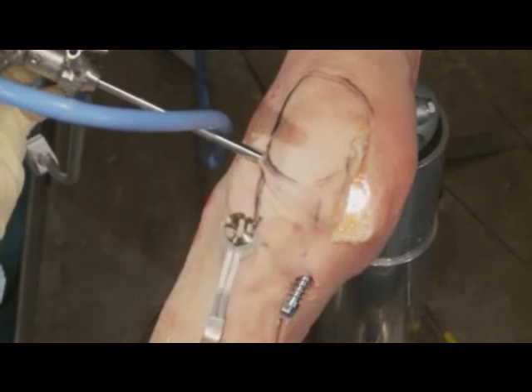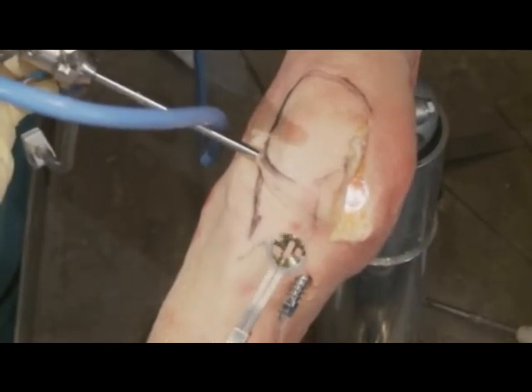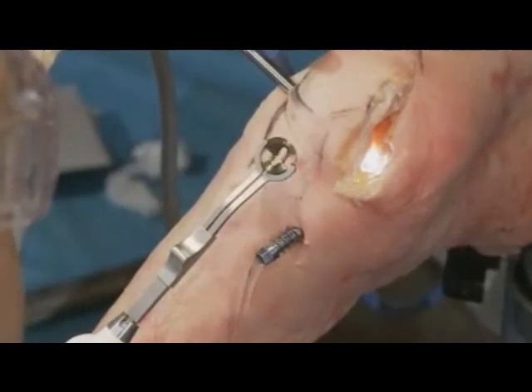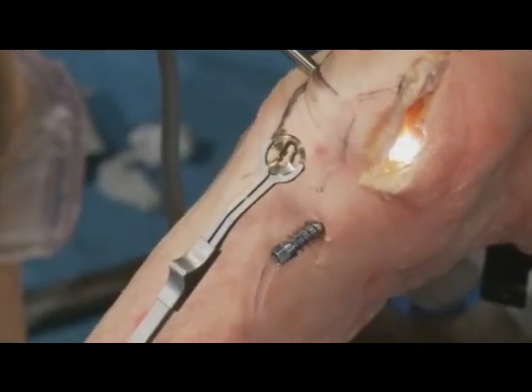So I just want to show you here, this is our blade that we're going to put into the knee joint. You see that it has a slot in the middle, and when we put it in arthroscopically, you can see that there's a little universal joint in the center.